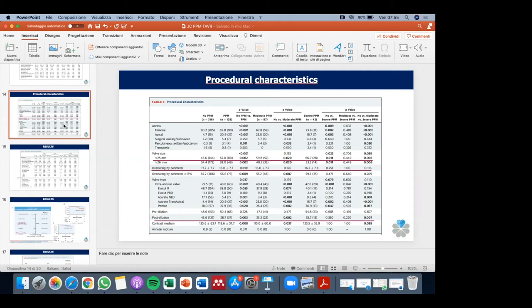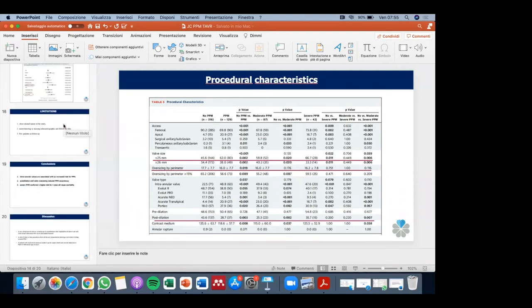Now I think we have to start thinking about surgical valve cracking that has to be part of the pre-procedural planning, because we know that we cannot do it with all the surgical valves. I mean, we know that in a patient at risk of patient prosthesis mismatch, we have to use a non-compliant balloon that is 1 millimeter higher in diameter as compared to the surgical valve. For example, for a Mitroflow 21, we have to use a non-compliant balloon 22 millimeter.